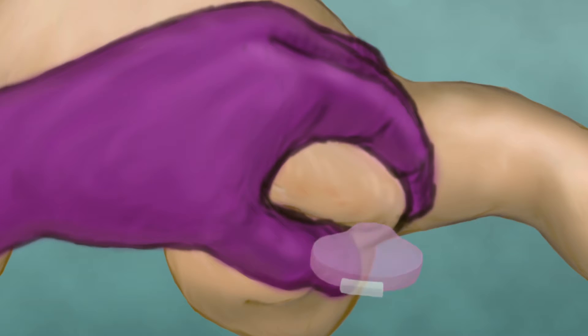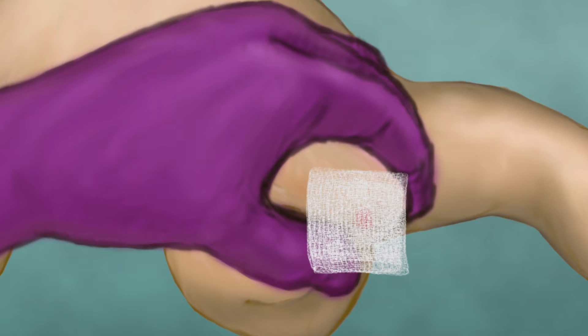If at all possible, it is best to avoid any recent puncture sites. Wipe away the first drop of blood with a gauze pad.